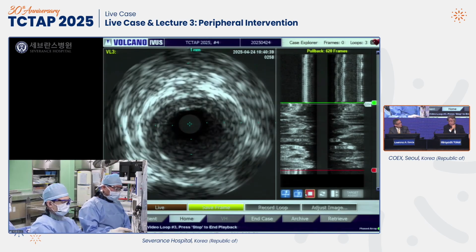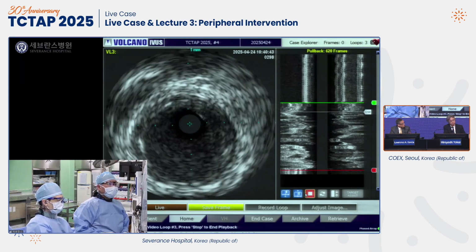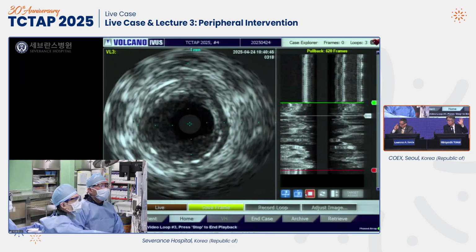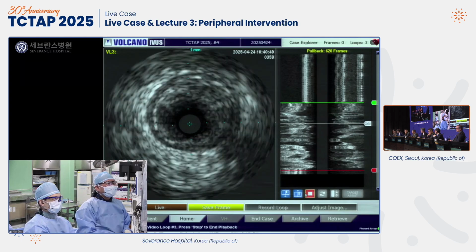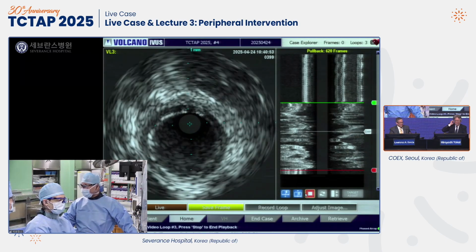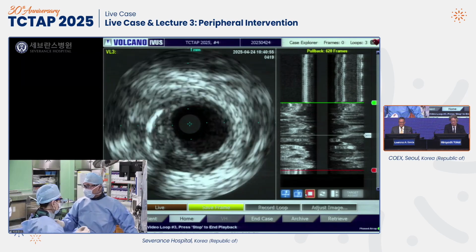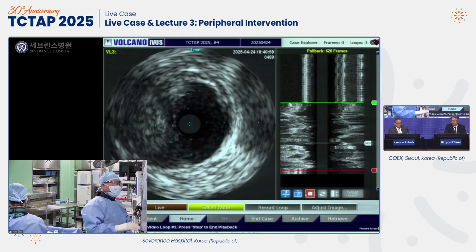Do you guys want to have a show of hands, or you want to vote? How many vote for pre-dilatation on this vessel? How many just say straight away with DCB? Okay, so consensus on our follow-up is pre-dilate there, Dr. Ko. NC balloon please. 550.